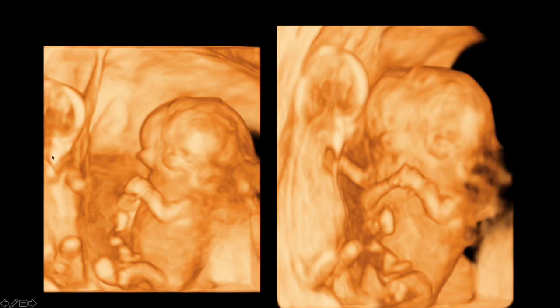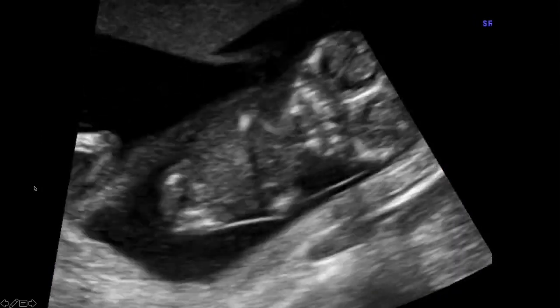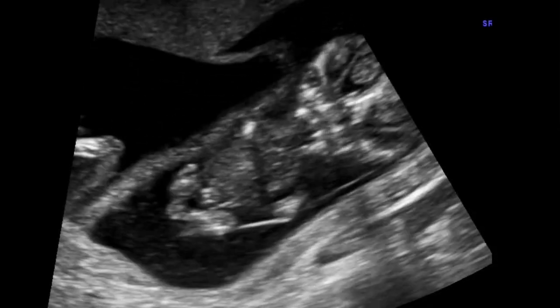And here you can see the other fetus over here that was normal. And this just shows you in real time what that looked like. There's also cystic hygroma, and you can see that there's another fetus on the side here.